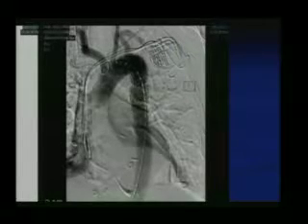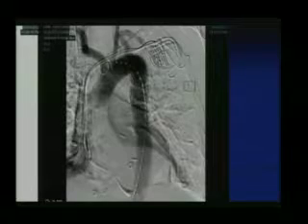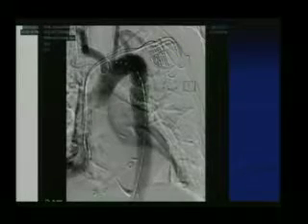Type 4 endoleak usually does not happen nowadays. It is because of the porosity of the stent graft material. But nowadays, they're very well advanced, and we usually don't see type 4 endoleaks anymore. And type 5 endoleak is the sac endotension, which usually happens in aneurysmal cases. If you're not able to identify whether it's type 1 or type 2, and still the sac is increasing in size, then you label it as a type 5 endoleak.